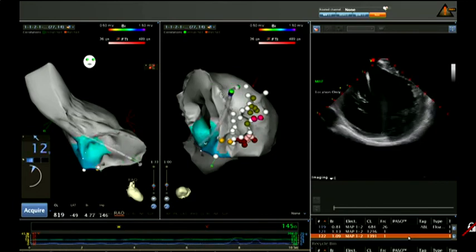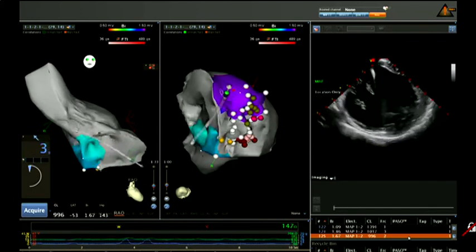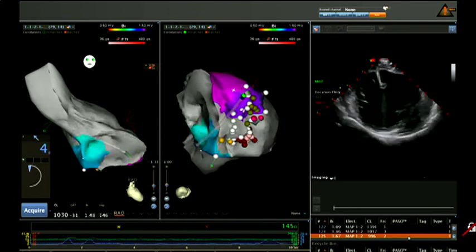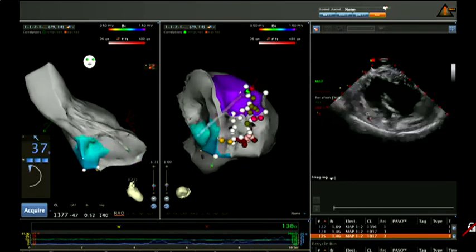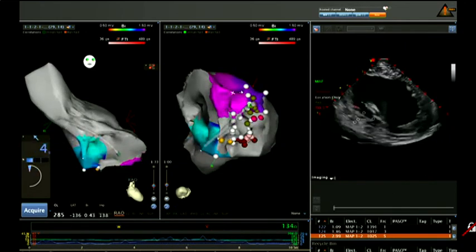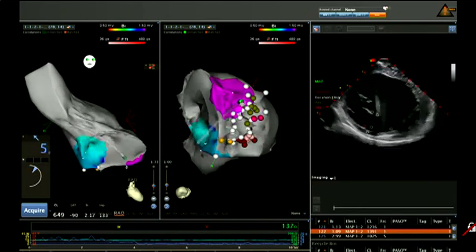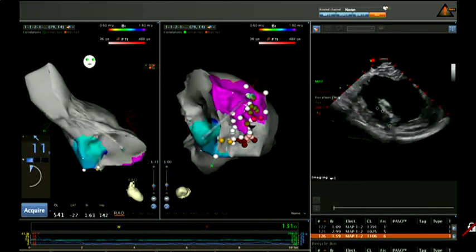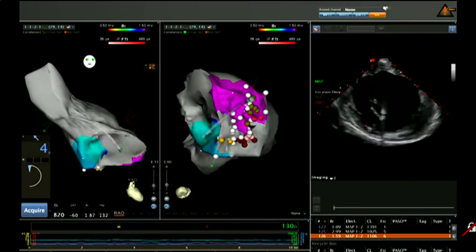Okay, let me go laterally. Yes, in sinus mode, please. And you tell me when you identify the point.